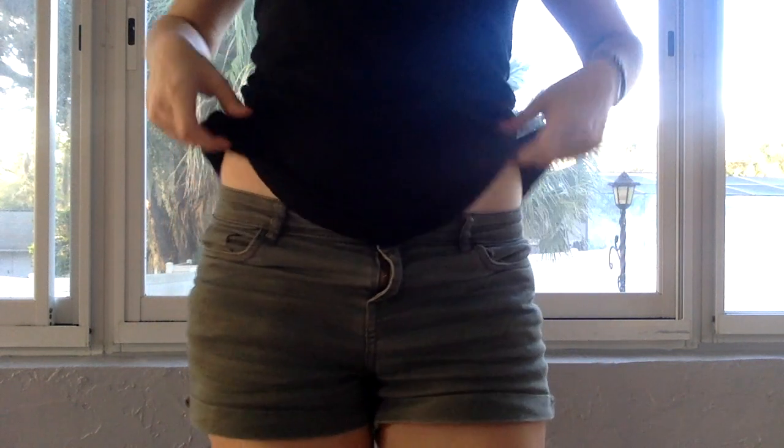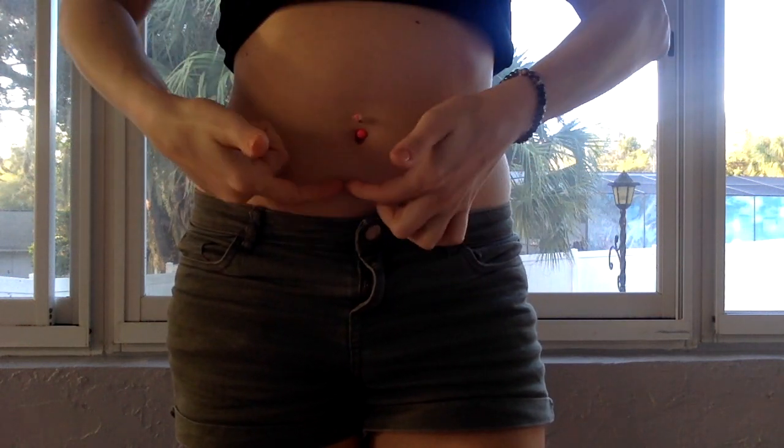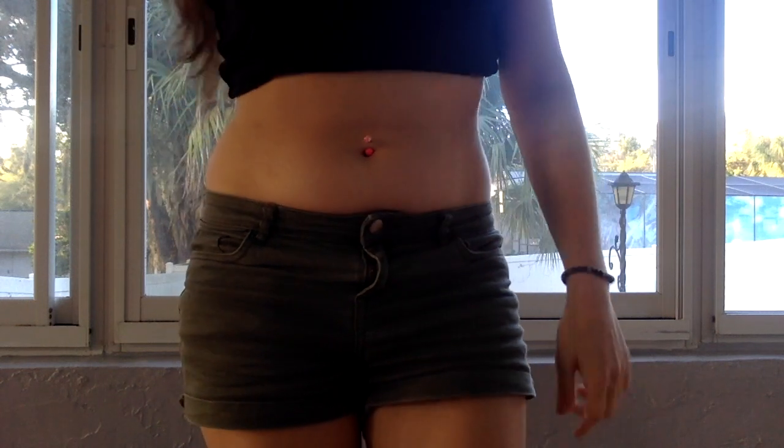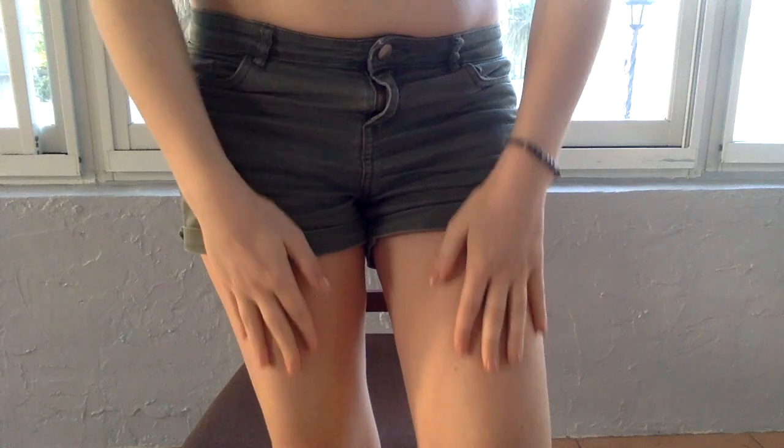The injection sites are in a U-shape under the belly button area, but two inches away from the belly button. So it's going to be in a U-shape like this, but two inches away from the belly button. And this upper thigh area here.